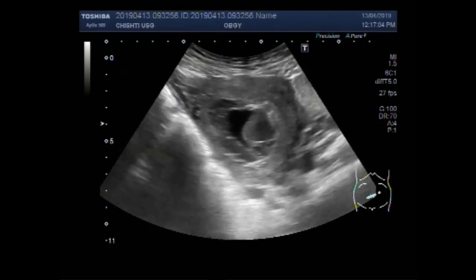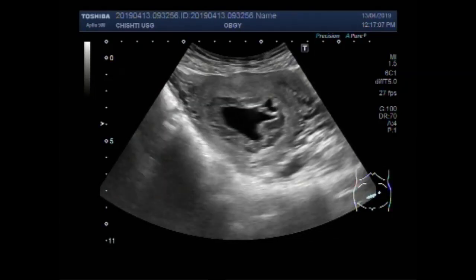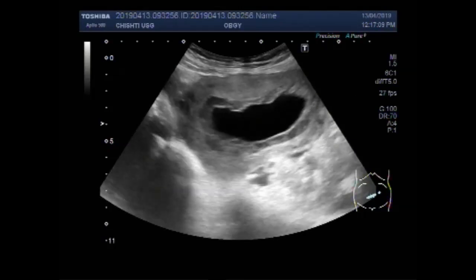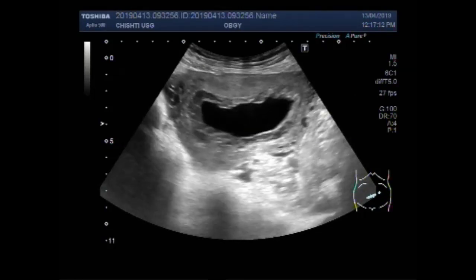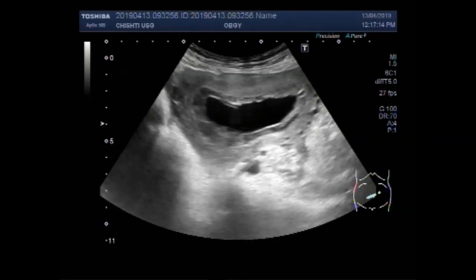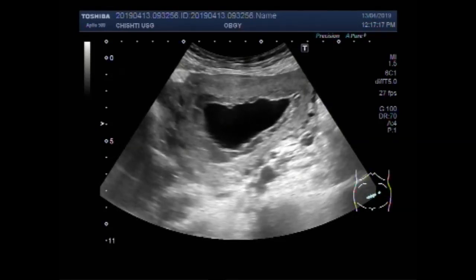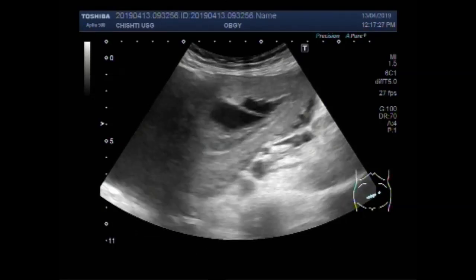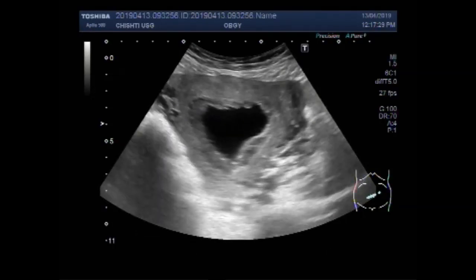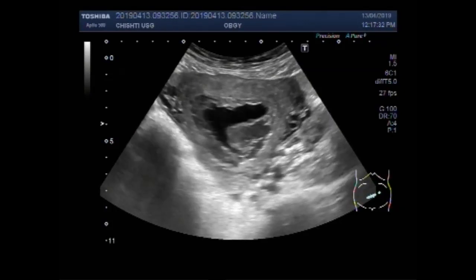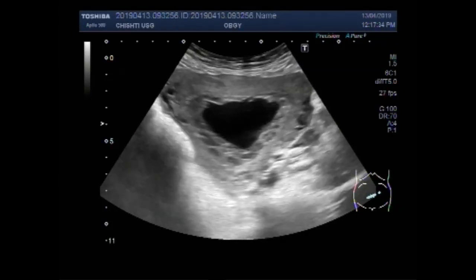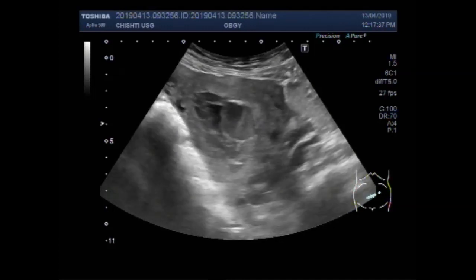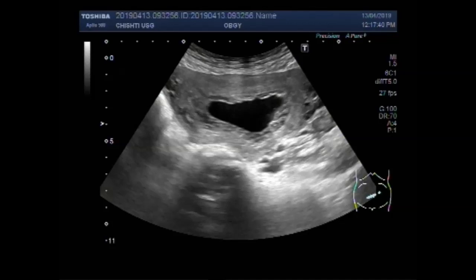You can see the gestation sac has a small POC in its middle portion. Now this is the measurement of the gestation sac. Another structure that looks like an endometrial polyp is also visible.